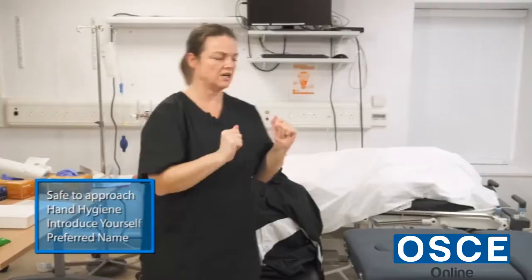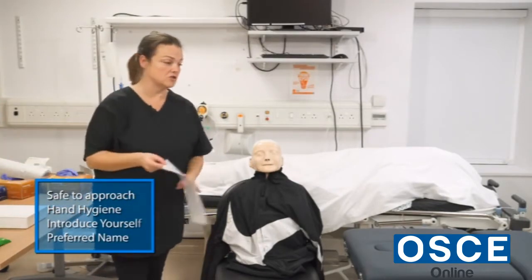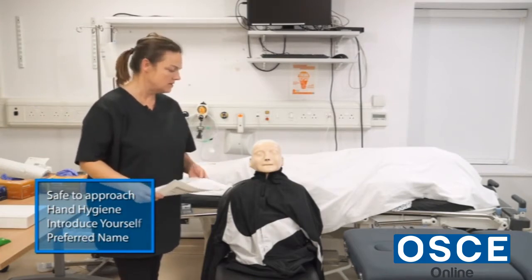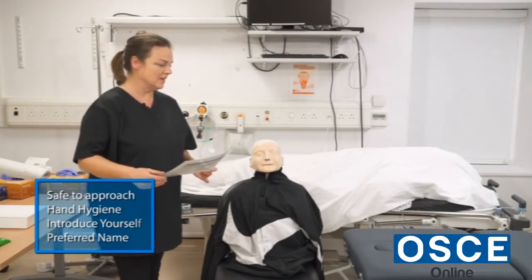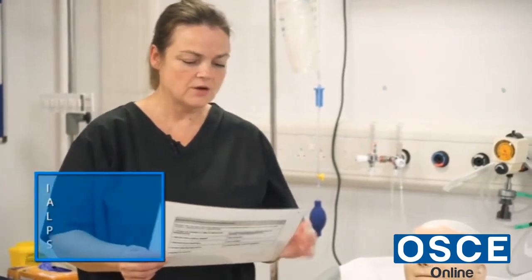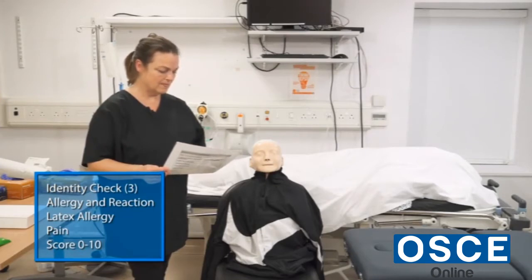30 seconds to dry. So with this one, I am going to go through the whole introduction and checking the patient's name. So my name is Helen. I'm the nurse who's come today to give you the inhaled medication. Could I just ask what you'd like me to call you? Peter. Okay, Peter. Is it okay to get your full name? Peter McNamali. All right. And what's your date of birth?